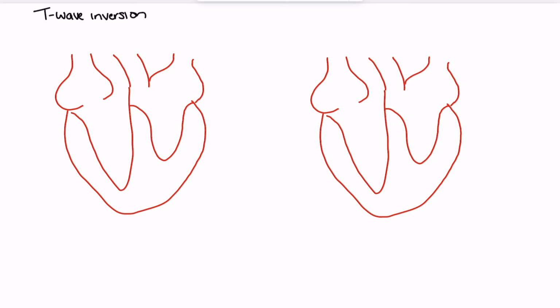In this video, we're going to talk about T-wave inversion. In particular, we're going to talk about T-wave inversion as it relates to cardiac ischemia. I do want to preface this by saying that cardiac ischemia is not the only cause of T-wave inversion, but in this case, we're going to be talking about specifically how cardiac ischemia can cause this finding on the ECG.